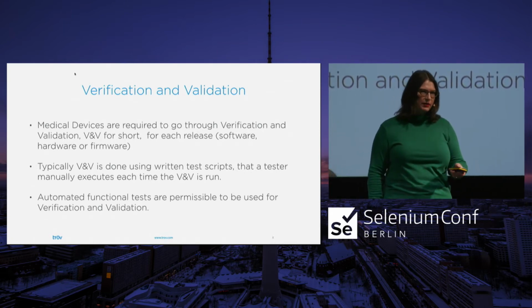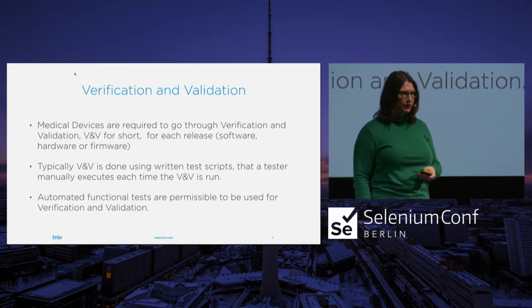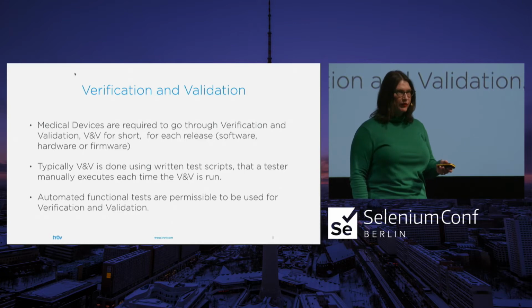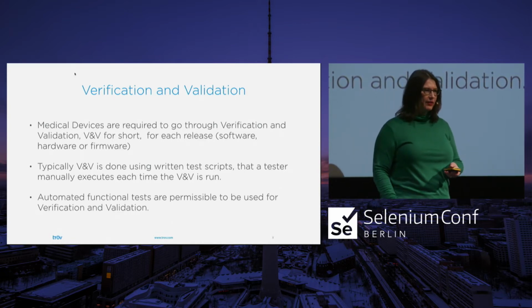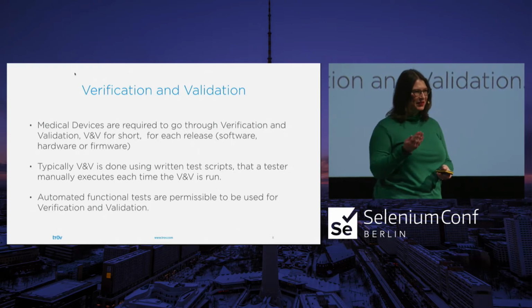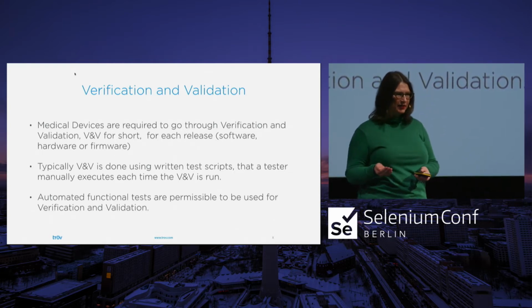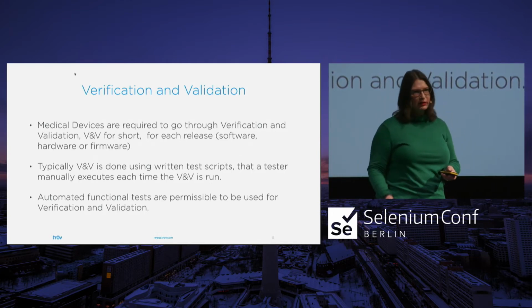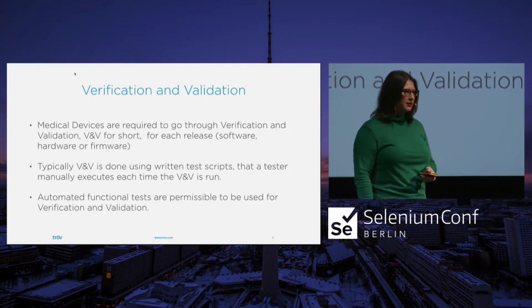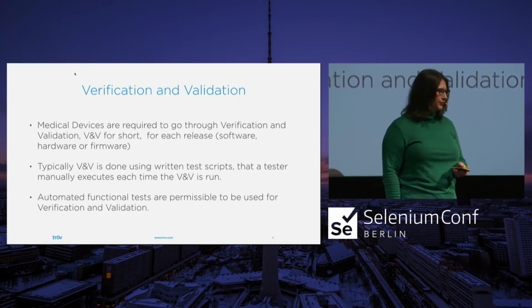So in order to test the iOS application, which is what the company I was working for had written and was doing the verification and validation for, we needed to have multiple versions of the IoT device in different states to do the testing. We also needed multiple phones, and we needed emulators or simulators. So you need a lot of stuff at your disposal to make that all work out.